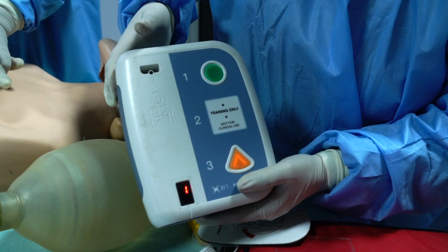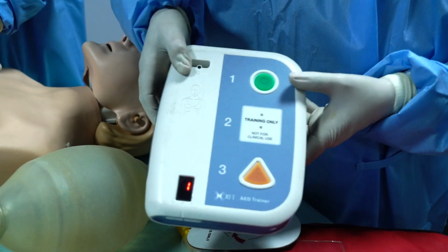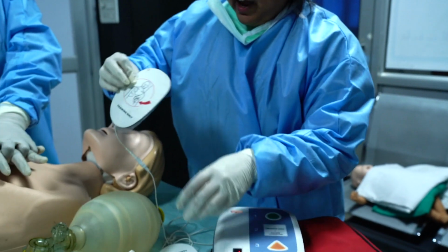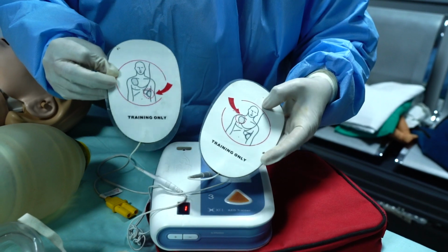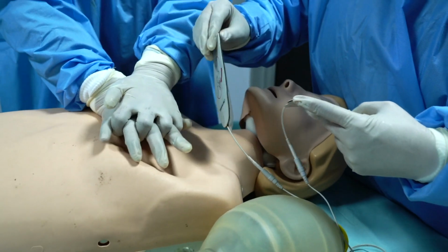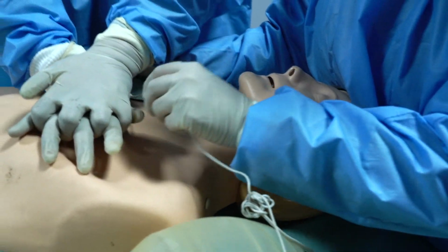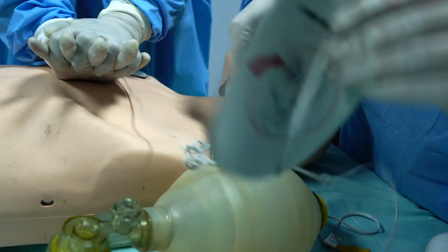As soon as the AED is on, the AED will start giving instructions: plug in the pad connector next to the flash. So what the AED is saying is, apply pads to the patient's bare chest, plug in the connection. So we have to apply these 2 pads on the patient's bare chest. The first pad goes on the right side, below the right clavicle. We will take this out and apply it over the right side below the clavicle, and then the left pad over the intercostal space.